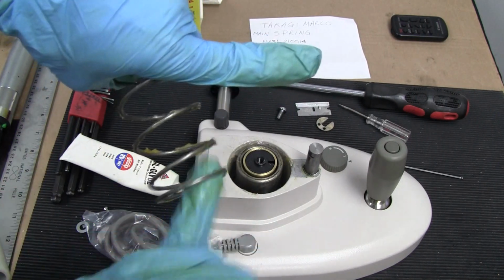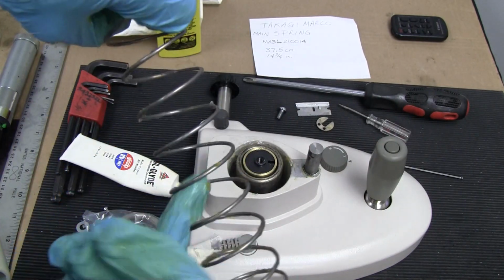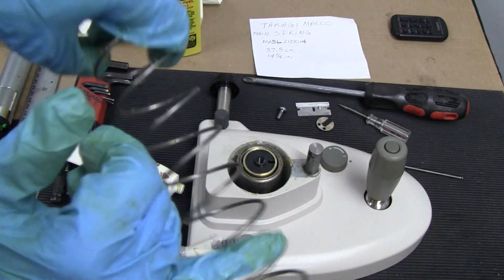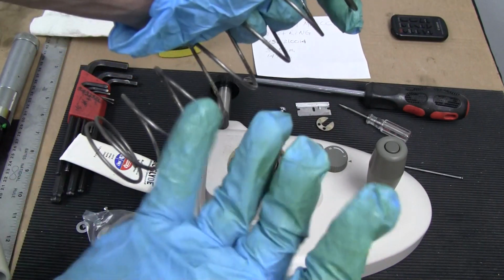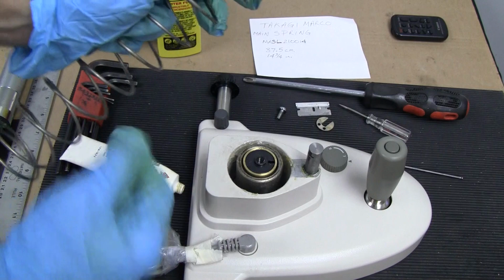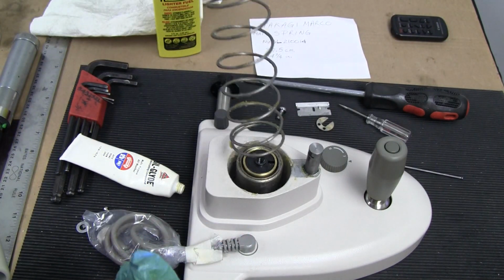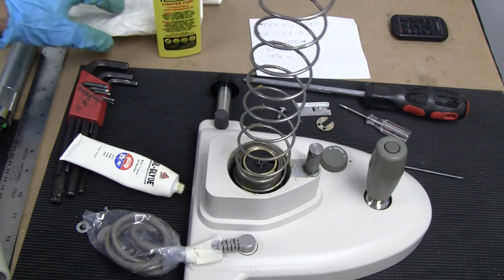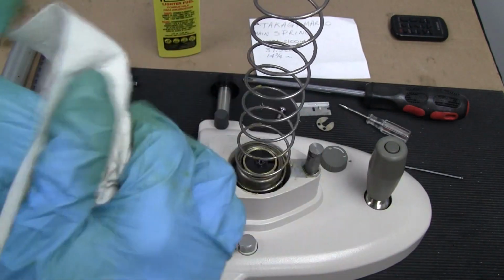A light grease all the way around, all over the spring, the inside, everywhere, all around it. Make sure you do the entire spring. It's going to get messy, so it's best to wear gloves. And make sure this spring is well coated with grease before you put it back on. Wipe your hands off.